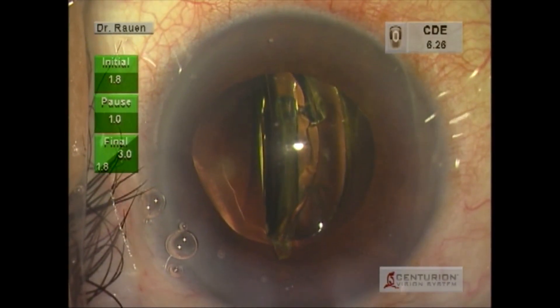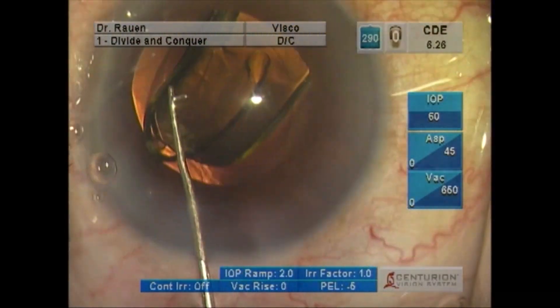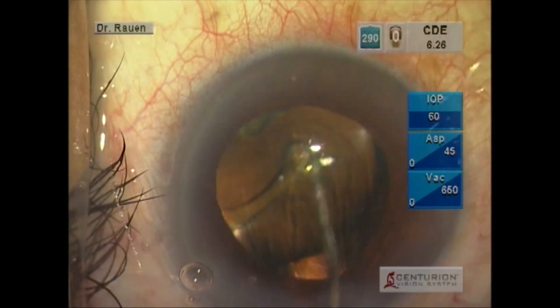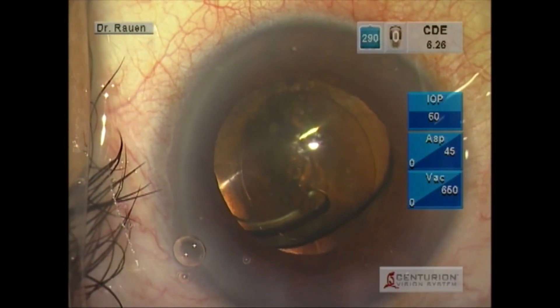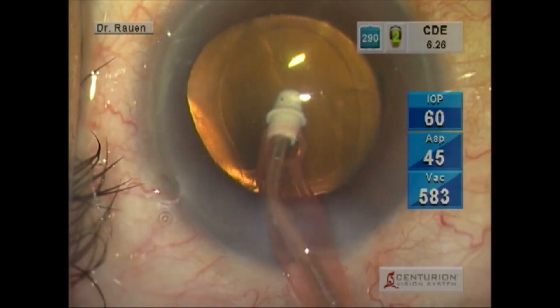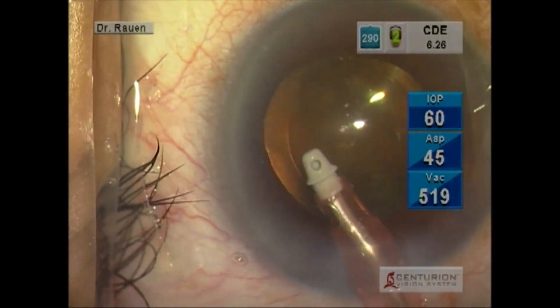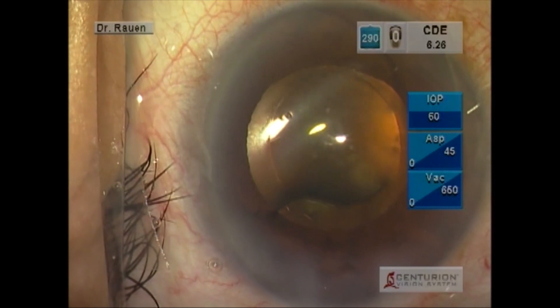You see very smooth introduction of the intraocular lens, and we rotate that into position. We conclude the case by removal of viscoelastic behind the lens and then above the lens, followed by hydration of the wounds. I think this is a system that is going to improve our cataract surgery outcomes.